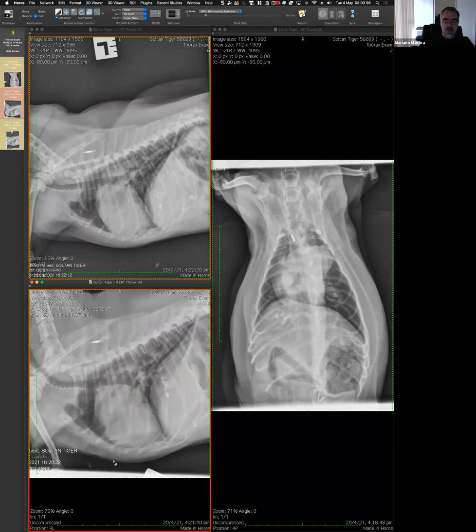So what I'm thinking now is, if you're looking at radiographs, everyone in this forum, other than me, is probably involved with the case, so you know what's going on. So then there's no option for you to take a look at the images without having that information. But if someone comes to you, just because you like imaging, and says, do you mind taking a look at the radiographs? One of my suggestions would be to take advantage of that absence of knowledge.